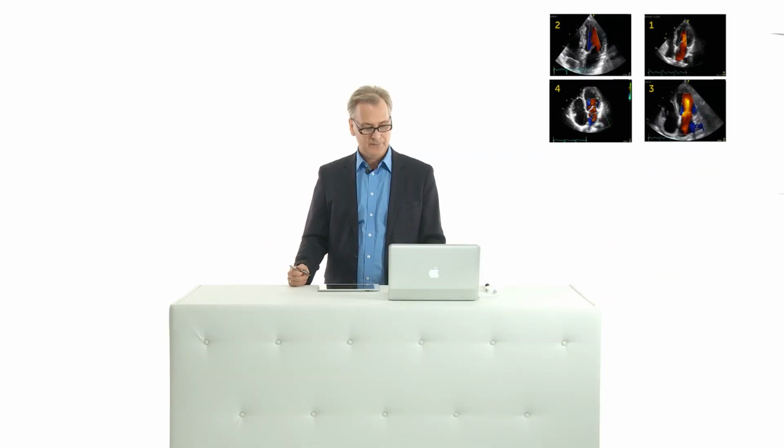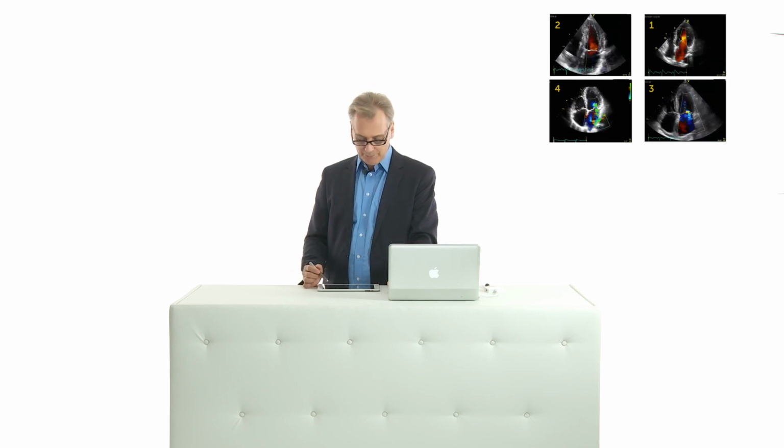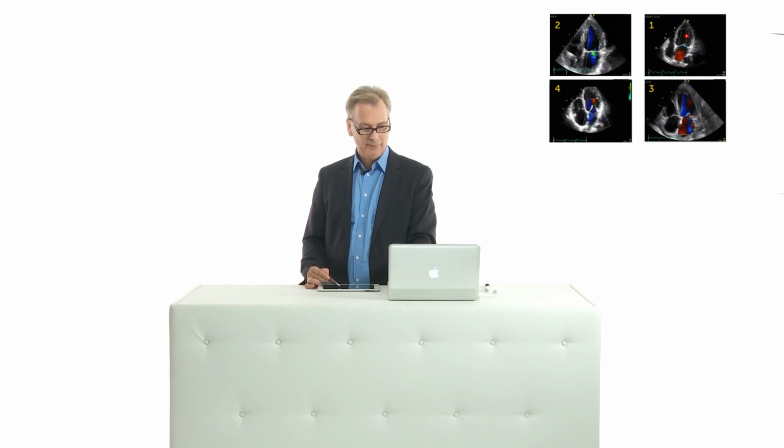So with the few rules I showed you, it's quite easy to quantify mitral regurgitation. Don't be put off in this case by the poor left ventricular function here. This patient has dilated cardiomyopathy, and therefore he has mild mitral regurgitation as a secondary finding.